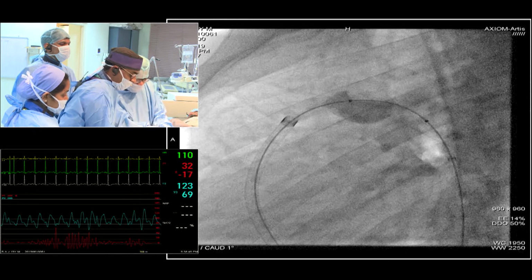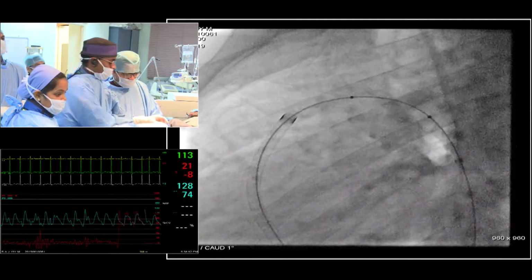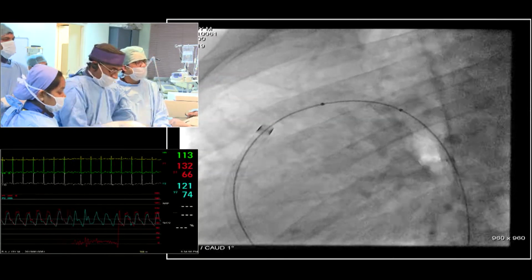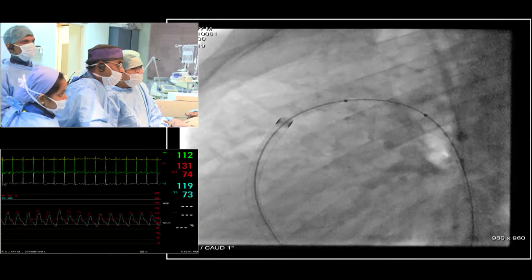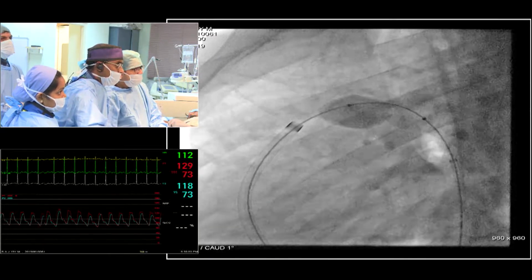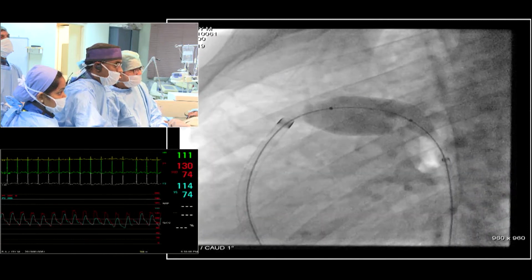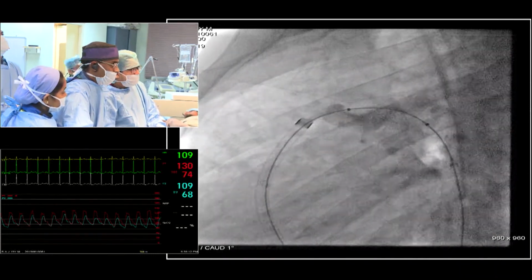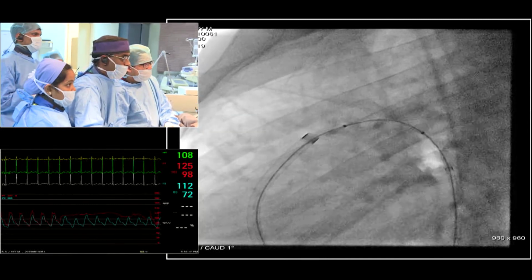Aortic pressure should be on the line. Check your PA pressures. Why is one line not showing? Okay, so now that means the balloon is occluding. Now it's coming. Fine. Give a gentle pull. Gentle pull more. Relax. A little bit more pull. Okay.